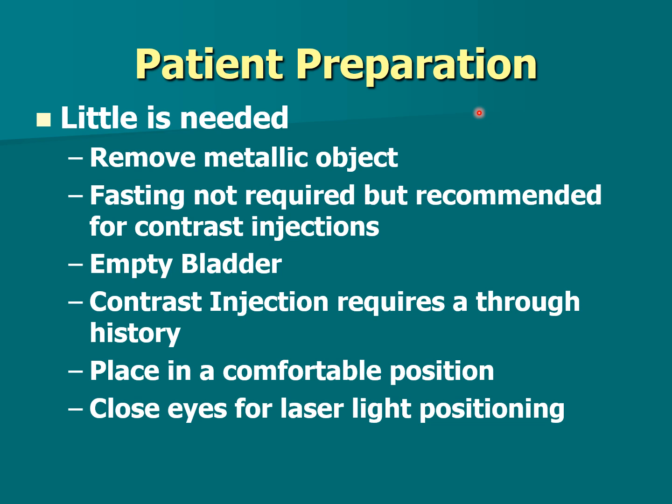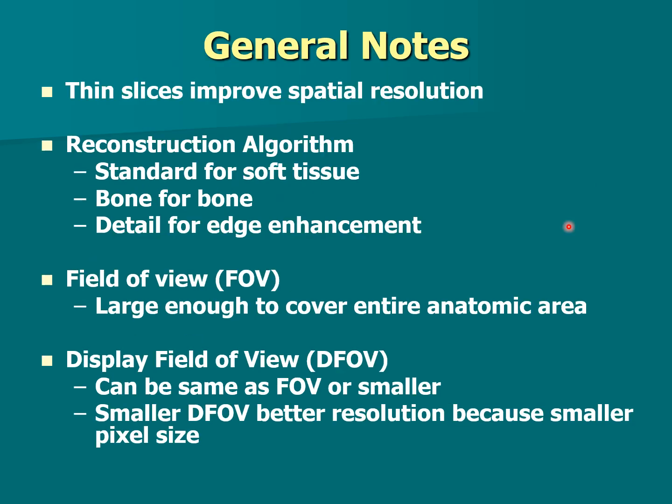We already know that. If we're giving IV contrast, we still got to know the BUN and creatinine, because we don't want to do any kind of kidney damage. Place in a comfortable position. If you can elevate their legs under their knees, do that. And we obviously ask them to close their eyes usually when we do the laser planning so that the laser light doesn't shine in their eyes.